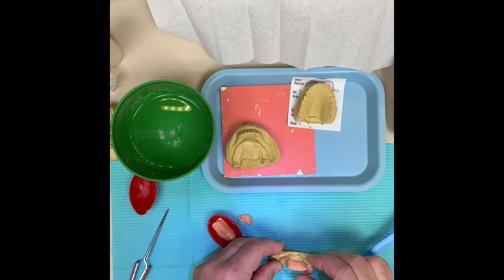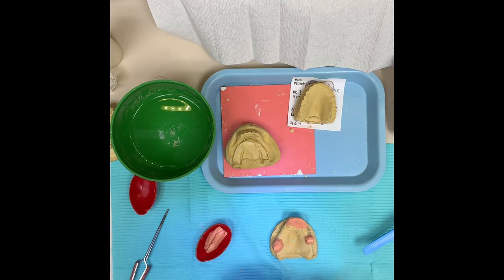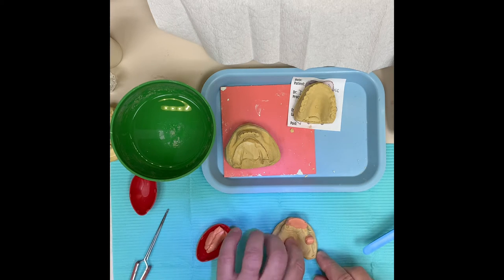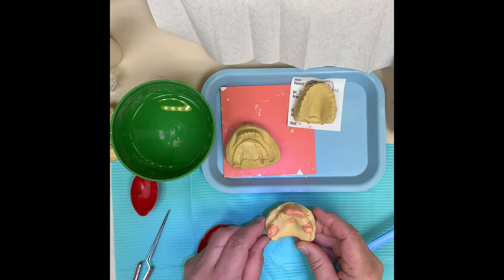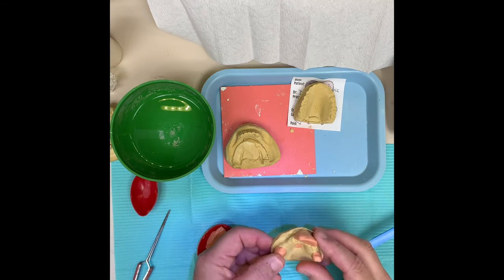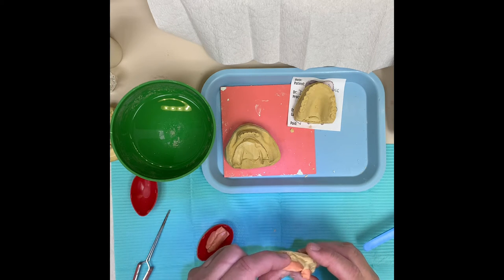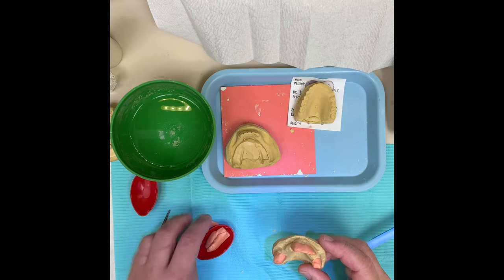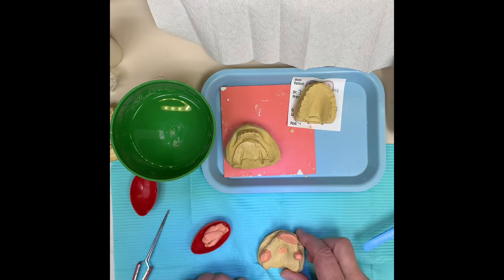These teeth are probably going to break off, but that's okay because this is not our final impression. If you have a defect you want to cover up and capture in the impression, like this hole that I inadvertently cut right there, that's basically what you want to achieve. You can also use this to make your base plate as well - these are real money-saving things that don't take that long to do.